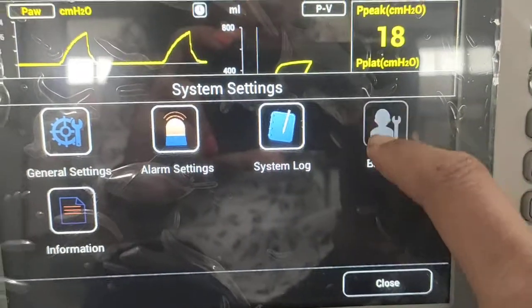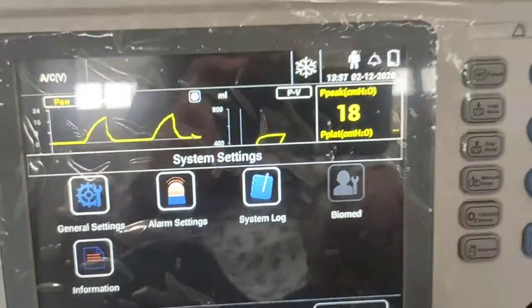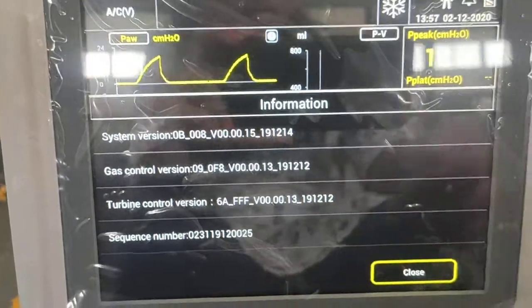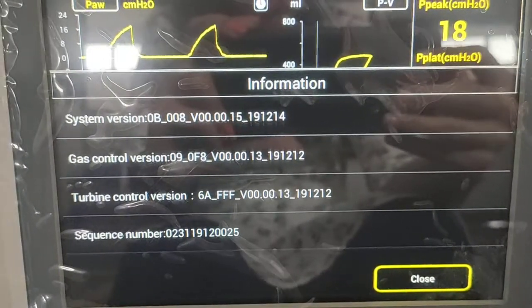The biomed option is present but disabled during normal operation — it is only enabled in standby mode. There is also an information section showing the system version, software version, and other related system information.